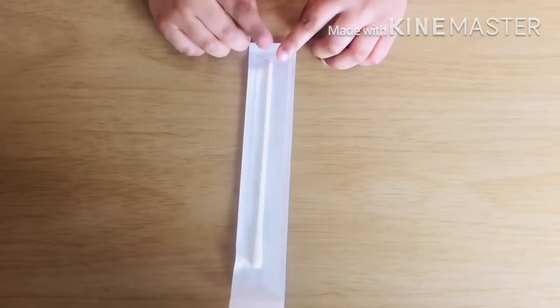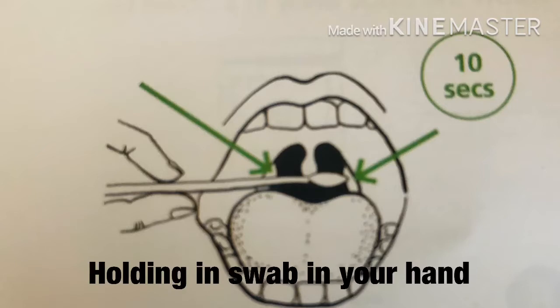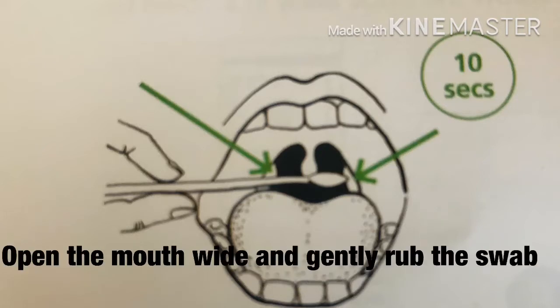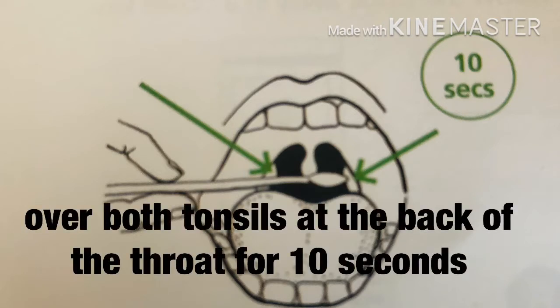This is the swab. We always touch here, not there — holding the swab in your hand. Open the mouth wide, and rub the swab off the back of the throat for 10 seconds.